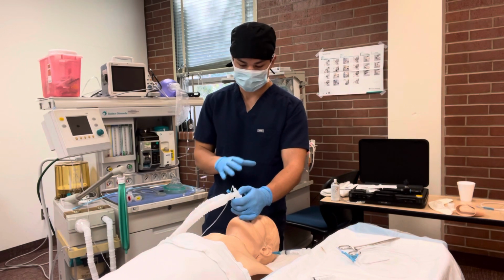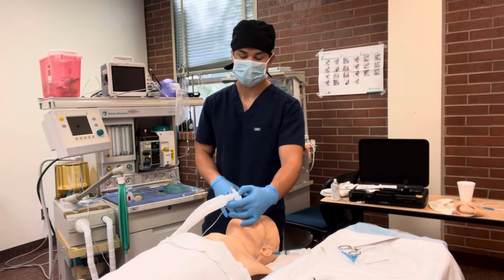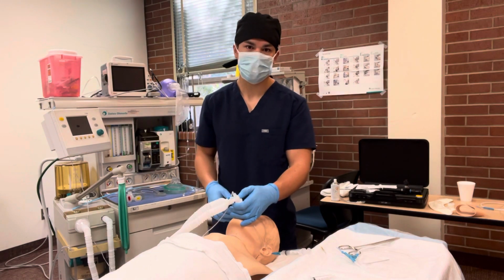Maintain my patient throughout the procedure and document the difficult airway, and let the patient or the patient's family know eventually about the circumstance of their difficult airway so that they can let their future anesthesia providers know.